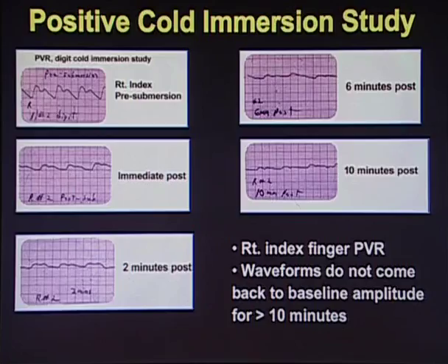So when waveforms come back within 5 or 6 minutes following cold submersion, that rules out a vasospastic component that's causing the patient's symptoms.